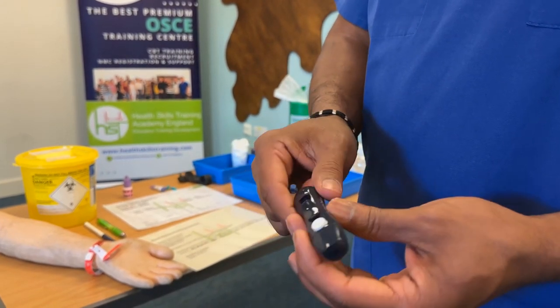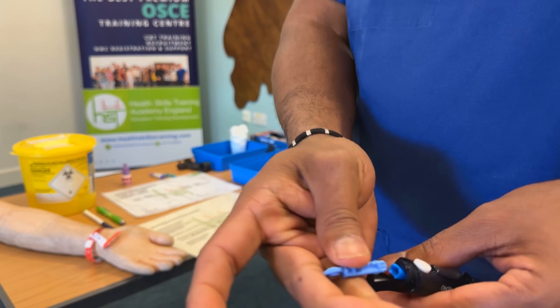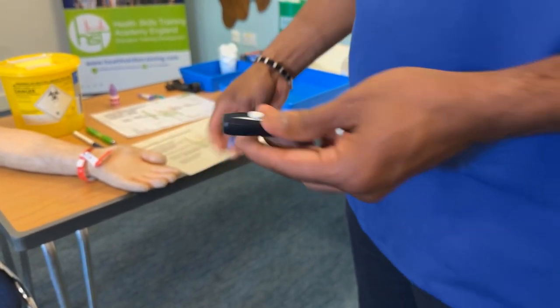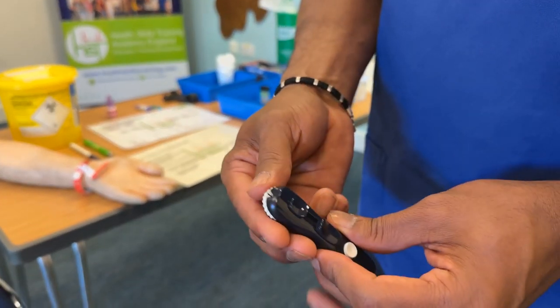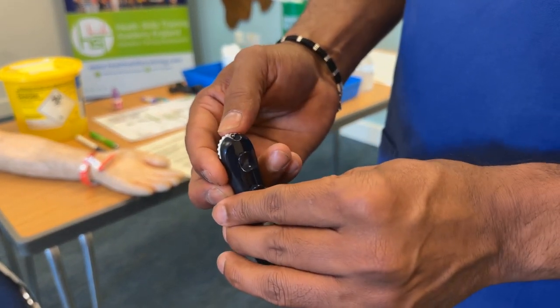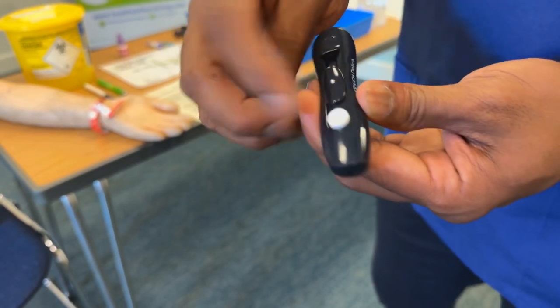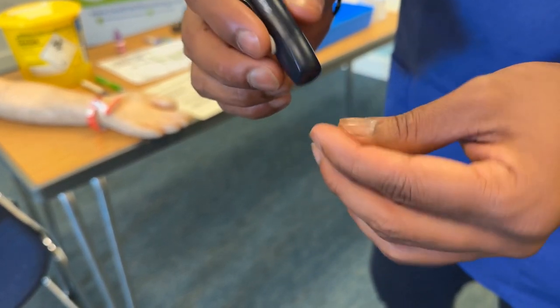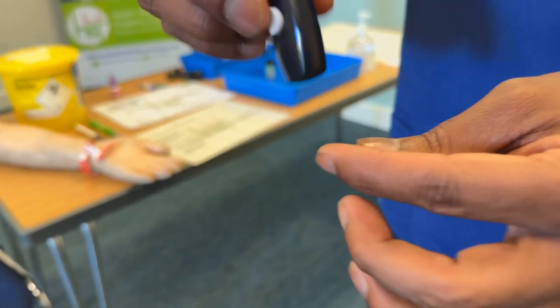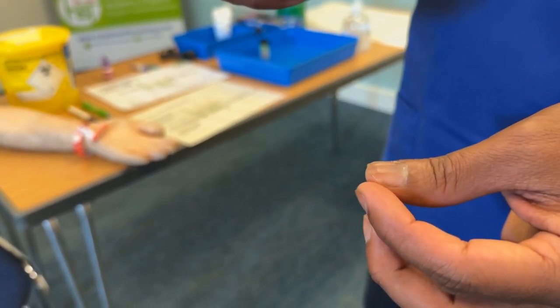Another type you can get is patient-specific, where you insert a needle into the device and close it. There are numbers on top — the bigger the number, the deeper the needle will go. Set the depth, then pull it back to load it like a trigger. Press the button firmly on the side of the finger; you can hear the sound as the needle fires and retracts, producing a blood drop. After use, the lancet goes into the sharps bin.